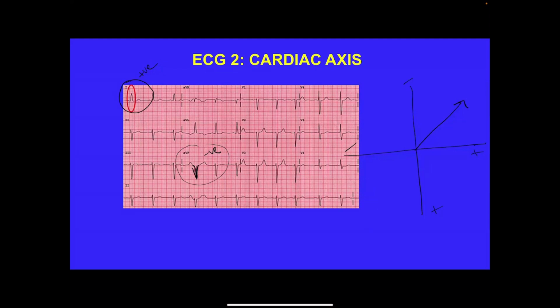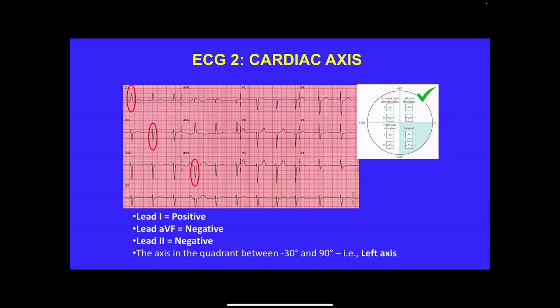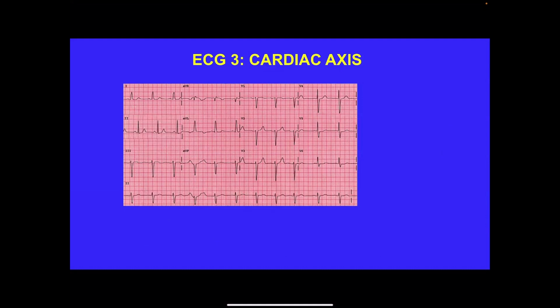Do you guys know how to apply what I'm drawing, or is it confusing you? It's clear. Okay. Okay, is this the same one? Or... yeah. Okay, what about this one?